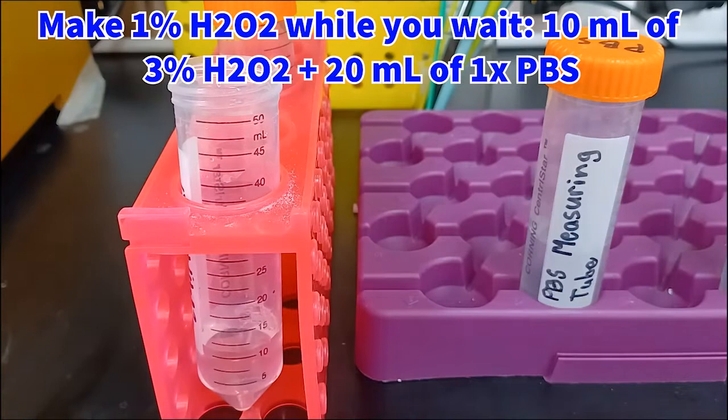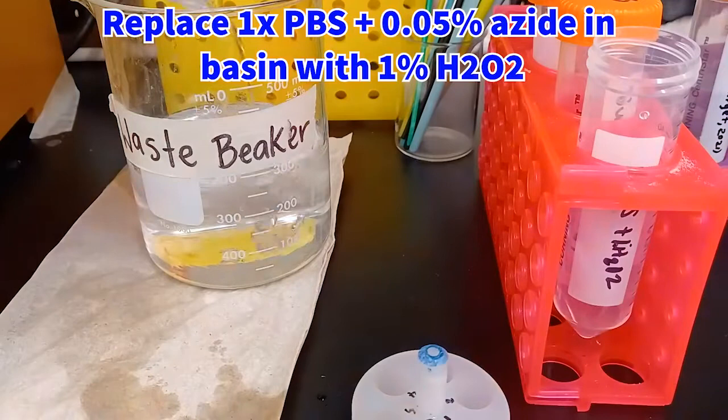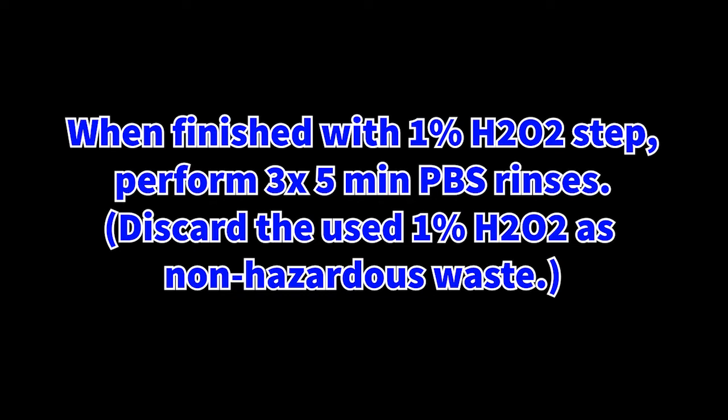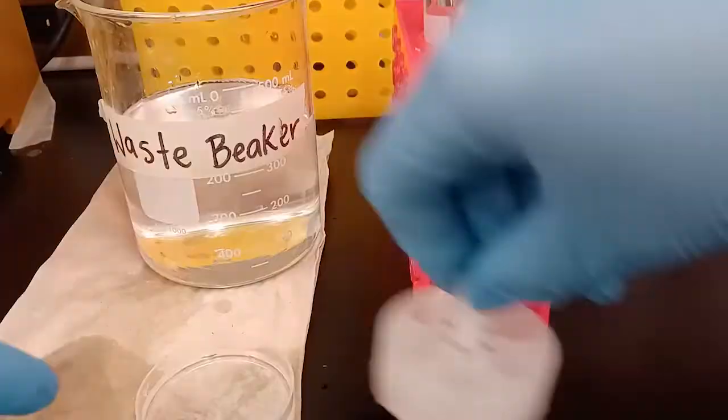While waiting, make a 1% hydrogen peroxide solution by mixing 10 mLs of 3% hydrogen peroxide solution with 20 mLs of 1x PBS. When ready, replace the 1x PBS plus 0.05% azide solution in the basin with 1% hydrogen peroxide and place back on the shaker for 10 minutes. This ensures full deactivation of the HRP donkey anti-rabbit secondary antibody from previous steps. When finished with the peroxide step, perform 3 five-minute PBS rinses and discard the used peroxide as non-hazardous waste.